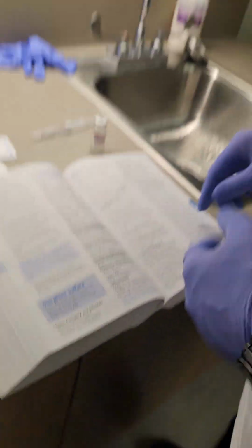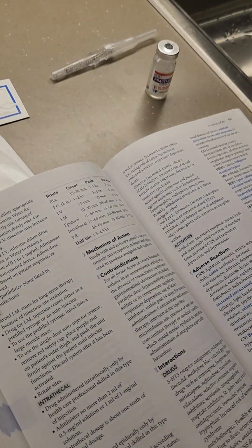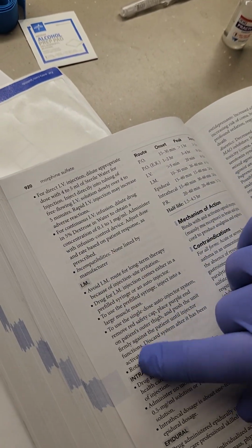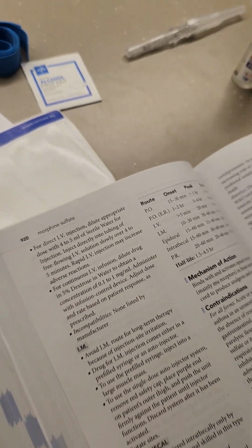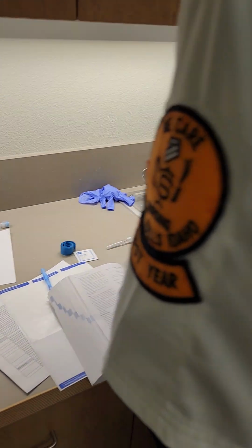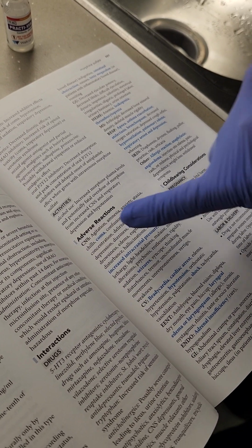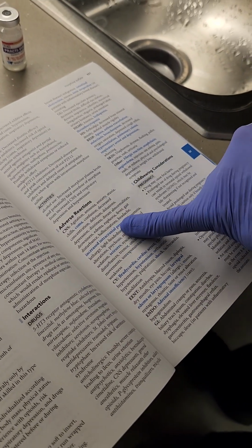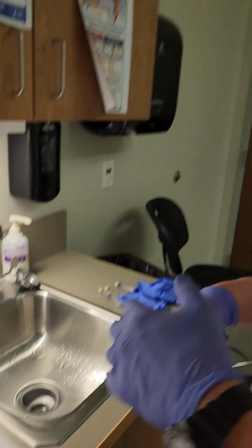And so it turns out I have to give it over the course of 4 to 5 minutes. And then I'll also be flushing it for an equal amount of time as well. But I also want to teach them things like why I'm hanging around. So I have to know the really important stuff like coma, increased intracranial pressure, or seizures, or just monitoring them for things like that.